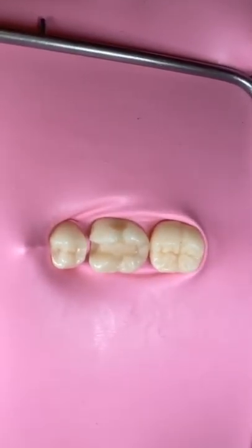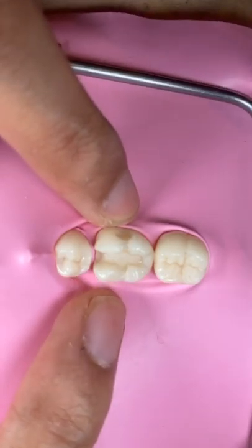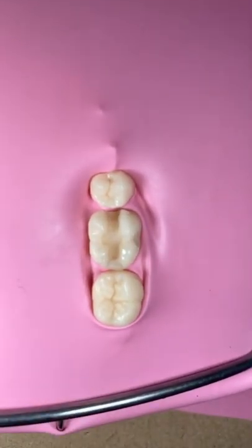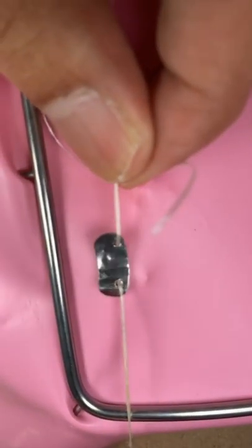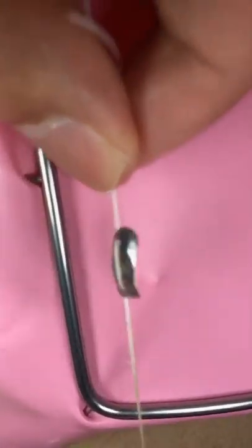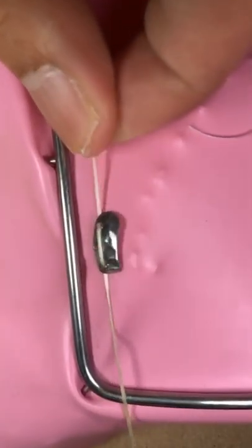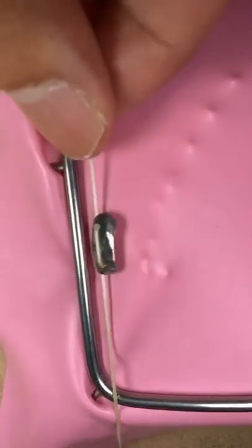So now, this is my cavity. Yeah, the mesial, mesio-occlusal, and I have buccal also. Maybe we have to make it landscape like this. So remember the previous live, I already created this matrix, the one with holes and the floss. This actually will work, especially for the simple case or very deep case where you are unable to place properly the matrix, because sometimes the cavity is very deep, very subgingival. This is the alternative to solve that case.